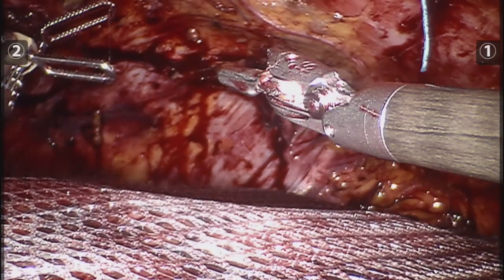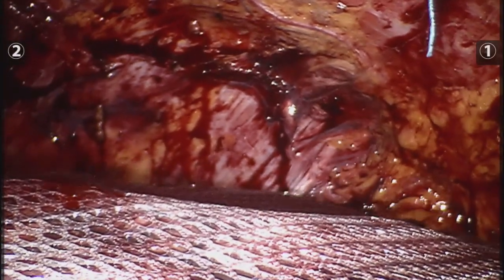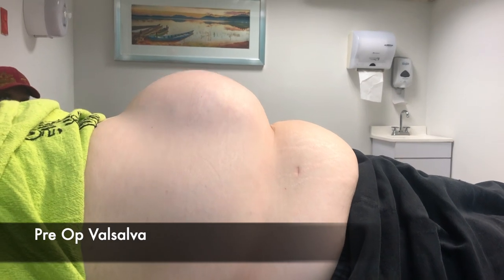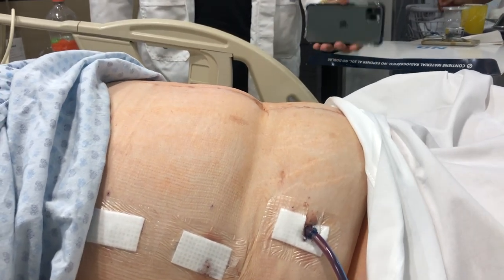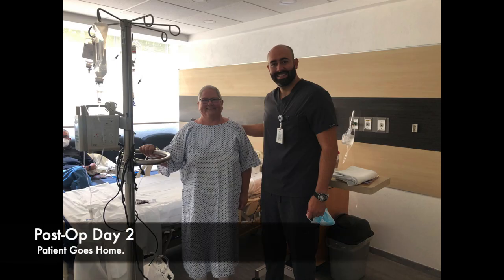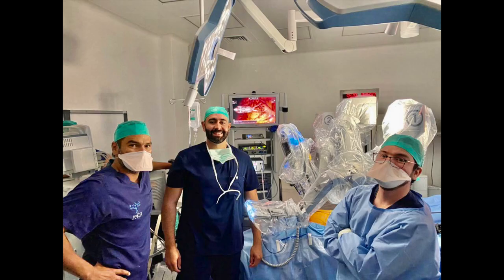I removed myself from the console and my assistants were gracious enough to place two drains. This is a video of the patient before the surgery — you can see both hernias protruding — and this is post-operative day one, where I'm asking the patient to do a sit-up and to cough, and I was very happy to see the hernia was well contained. This is her and I on post-operative day one, and on day two she's already ambulatory — she was discharged from the hospital on post-operative day three. Thank you all very much for watching, and I appreciate any criticism so I can improve.